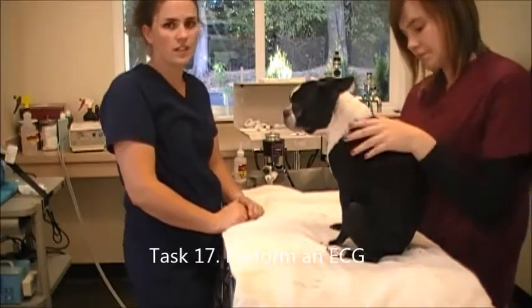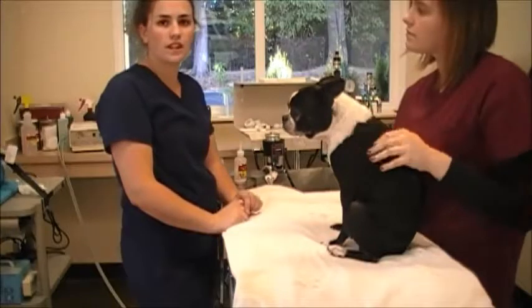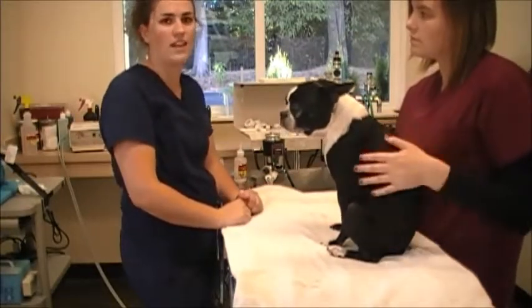I'm performing an EKG or an ECG, which is an electrocardiograph. We're going to use clips that can clamp on the arms and legs, and this is going to measure the electrical activity in the heart.